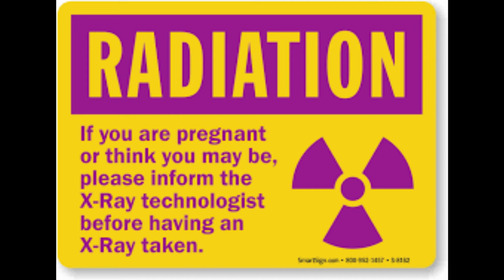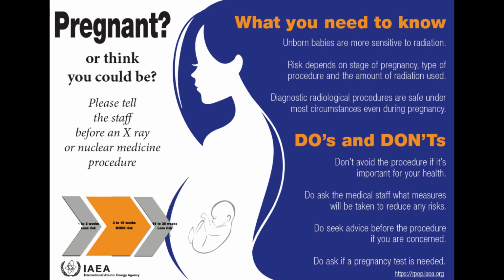Women should inform their physicians and x-ray technologists if there is any possibility that they are pregnant. Many imaging tests are not performed during pregnancy so as not to expose the fetus to radiation. If x-ray is necessary, precautions will be taken to minimize the radiation exposed to the fetus or body, and proper consent of the patient is also required.